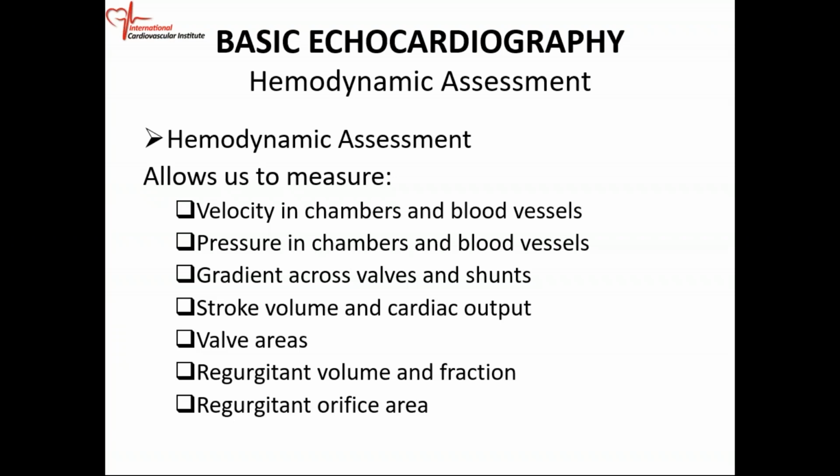So we can apply the Doppler principle and combine it with our hemodynamics to get velocities. So we can get velocities of chambers and blood flow in blood vessels.